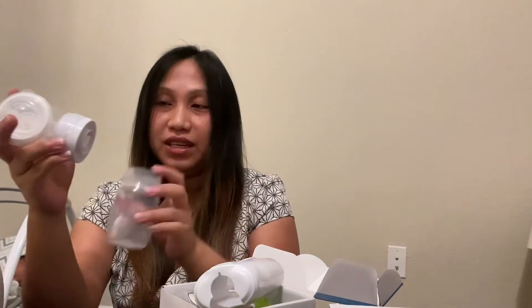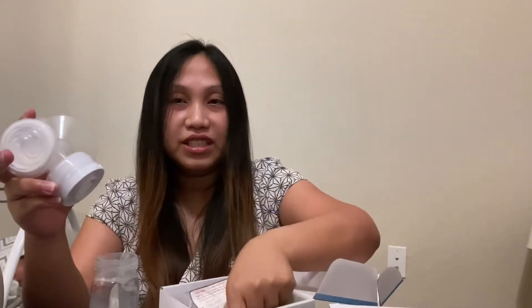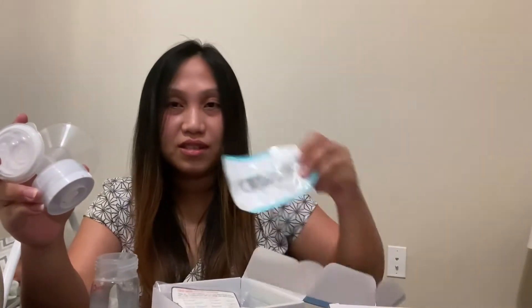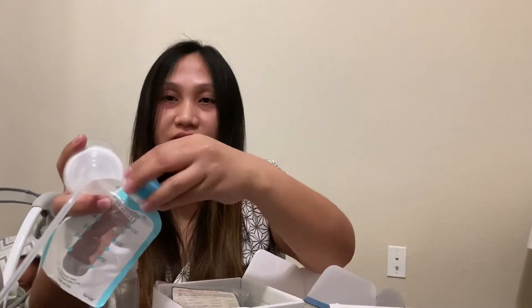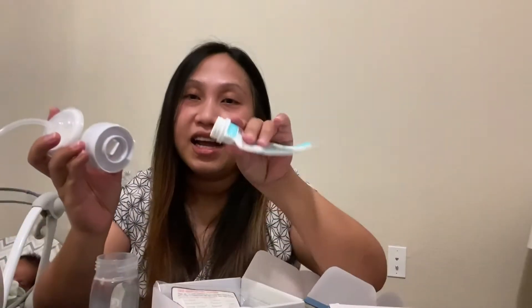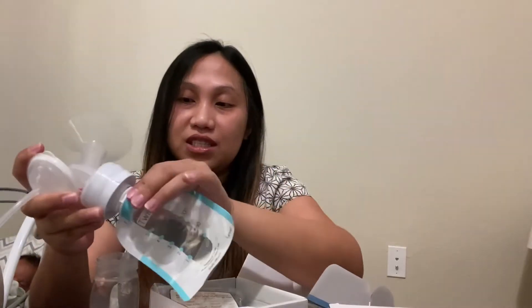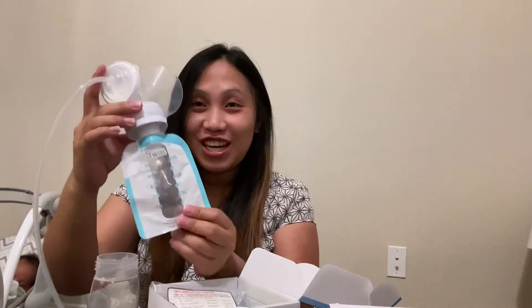The Spectra has a wide neck, so you're going to put this connector on like that. It includes one pouch — you open the cover first, and it has a small opening. You twist it directly on there so it's tight and then you're ready to pump.